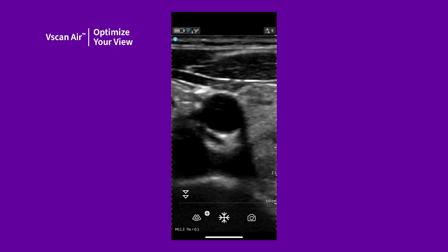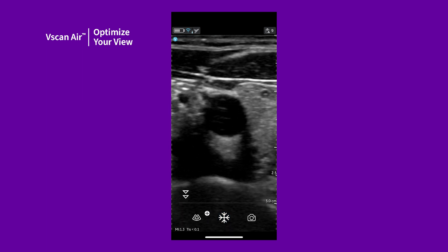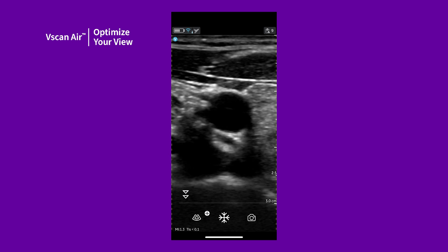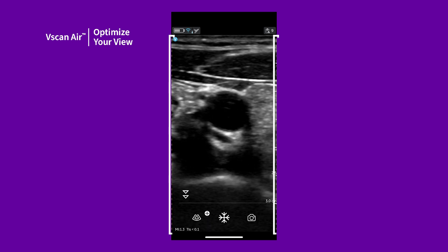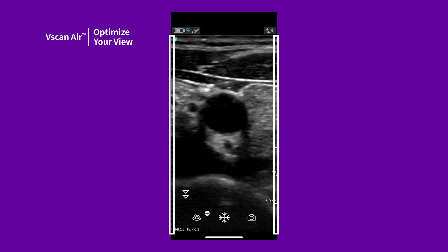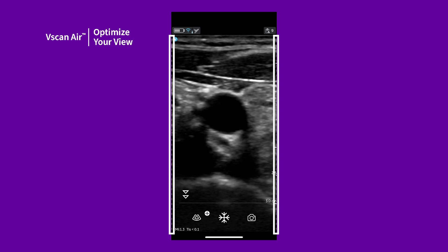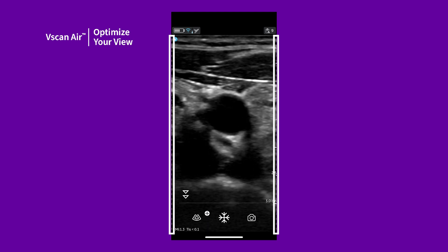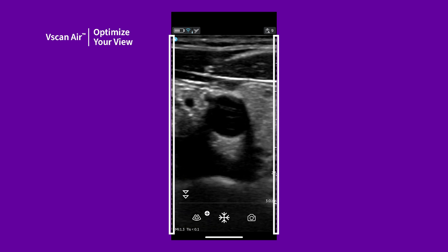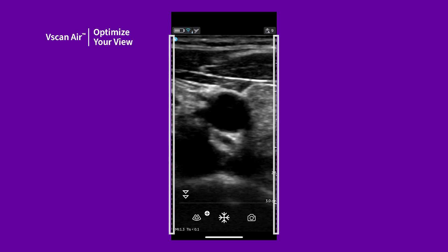The image display is maximized in the portrait orientation for better visualization. At shallow depths on the linear presets, you may see two yellow dashed lines on either side of the image. These image crop indicators tell you that the image corresponding to the entire transducer footprint is not visible on the screen in portrait mode.